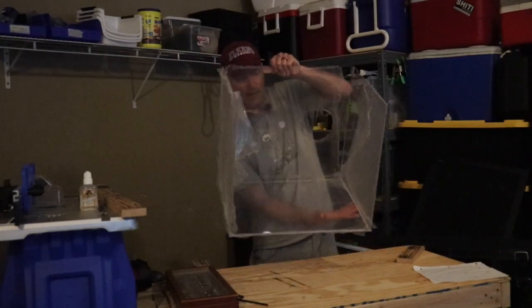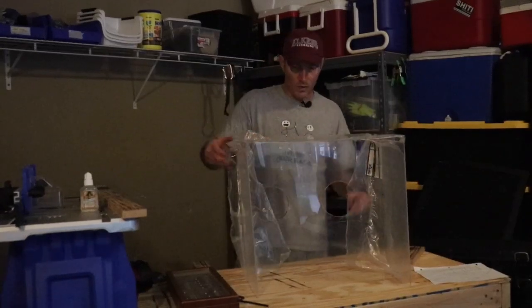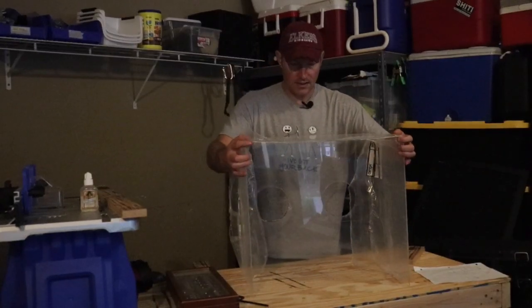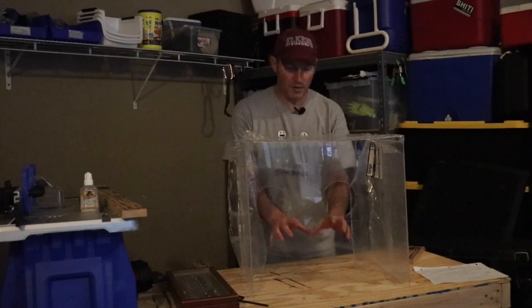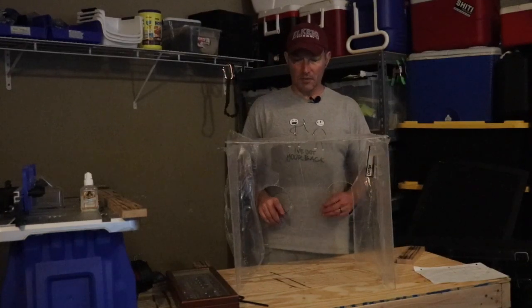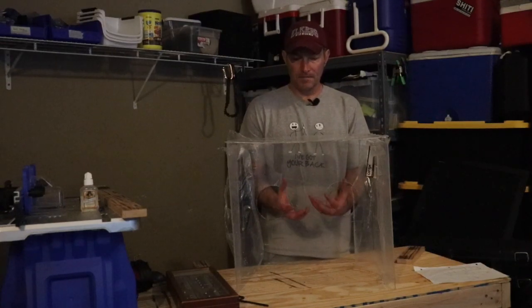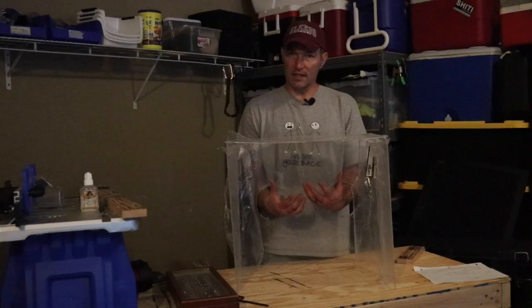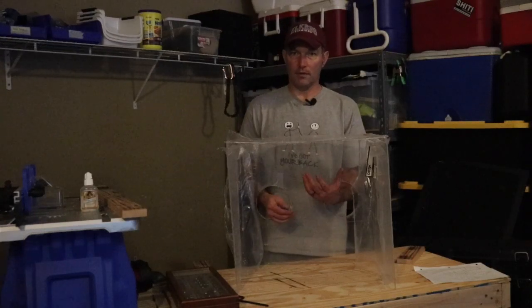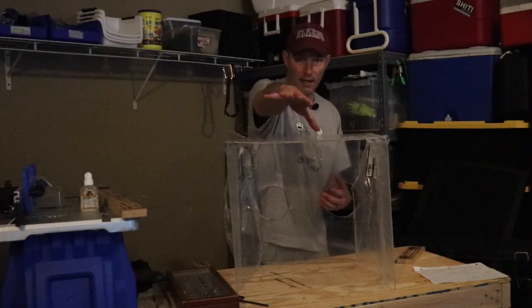Take our blocks out. So the box is going to sit like so, right? So it'll sit just like this. Patient's head will be right in here. So what I'll be able to do as an anesthesia provider is intubate, extubate a patient right inside of this box. If they cough, the box is going to catch everything that they spew out. Whatever this doesn't catch is going to go this way and come out towards the front.